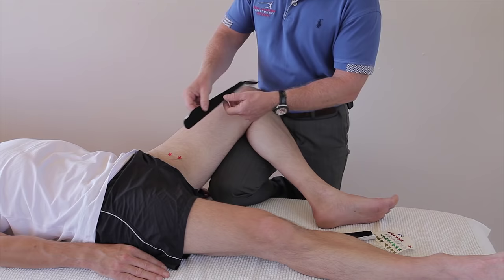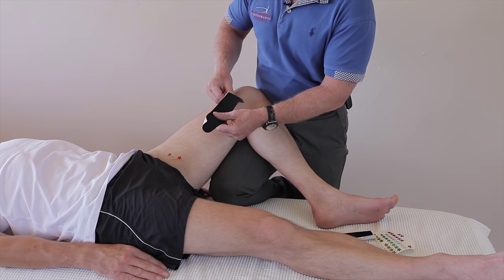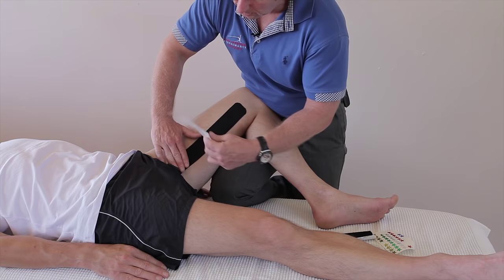So looking at the measurement here, I want to roughly cross that area. I'm going to go down towards where the adductor magnus will insert on the adductor tubercle, and the gracilis will pass to the pes anserinus. So one of them is going to go to that inferior part — like so — with little to no stretch, laying it down so it comes right under there. That's the first part.